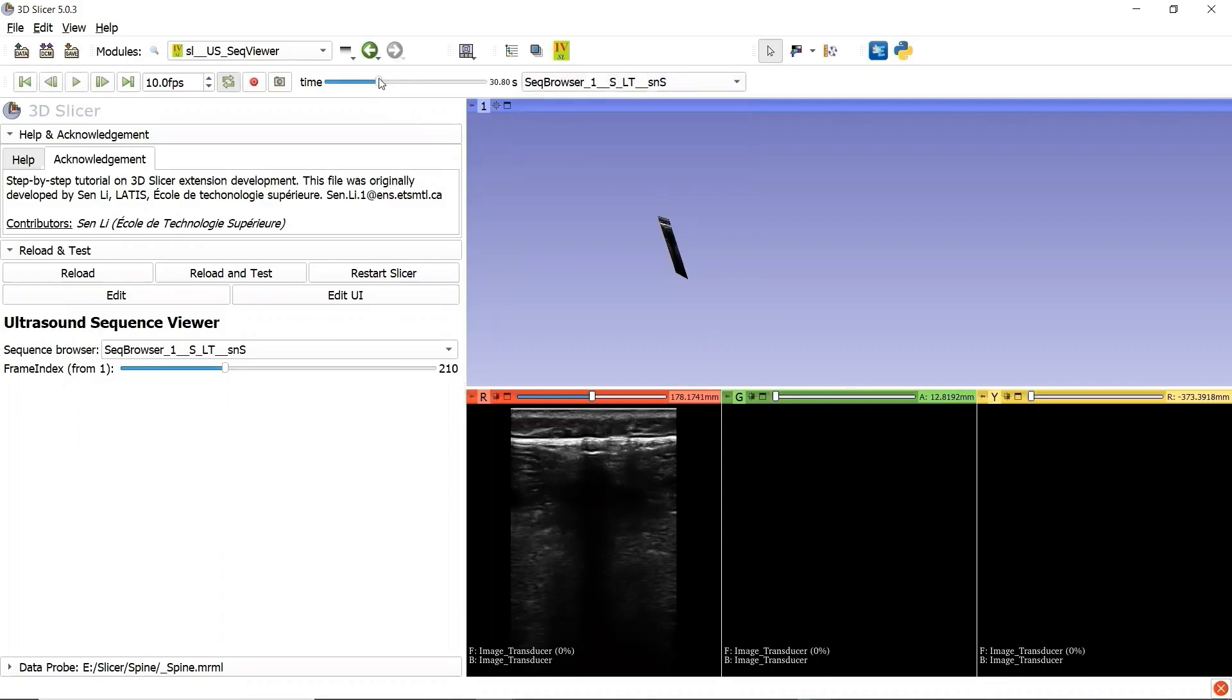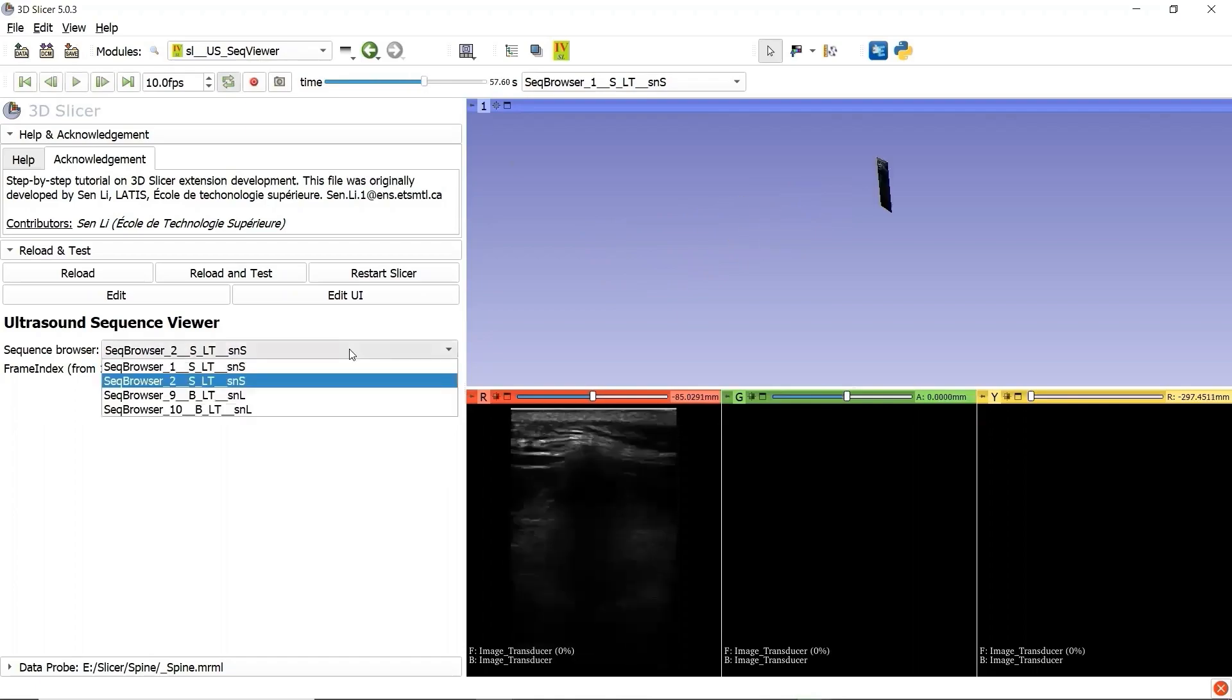Only if we slide the time slider, change the selected value of the time slider, we can observe the update of the ultrasound image. This can be a small bug of 3D slicer, and we fixed this bug by using a small trick in our custom module.